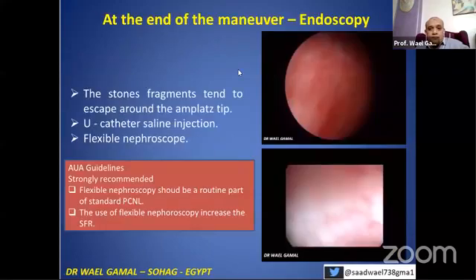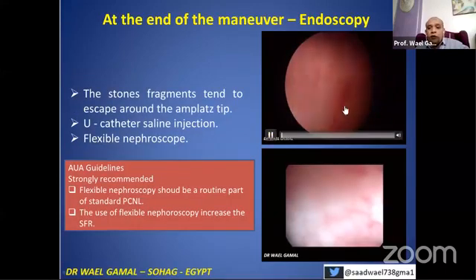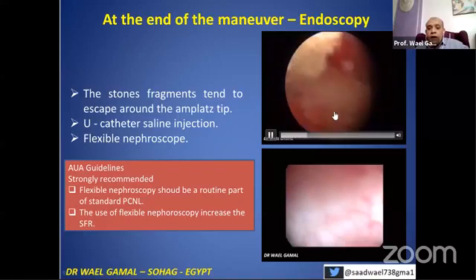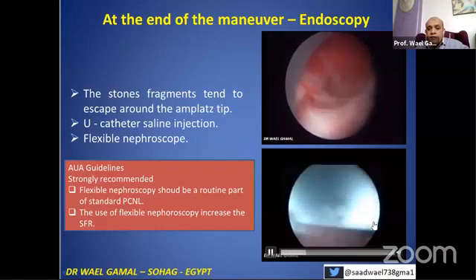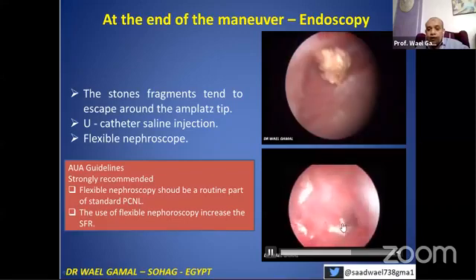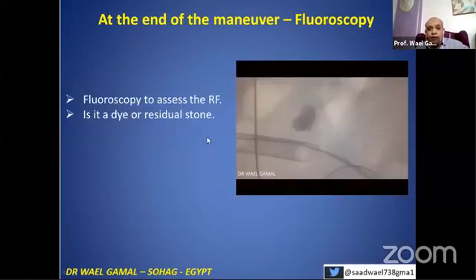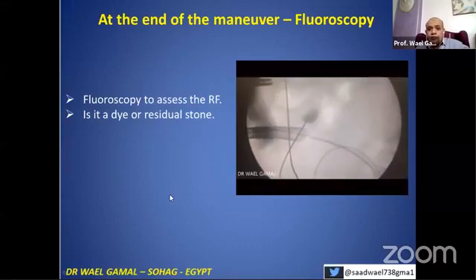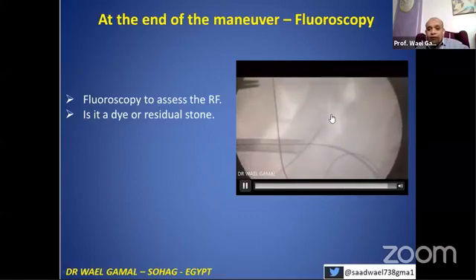At the end of the maneuver, we have to evaluate thoroughly. You have to evaluate the stone fragments — withdraw your sheath. Mostly there is a stone behind the tip of the sheath that has escaped, or gravel from disintegration. You need to evaluate this area very well. Sometimes massive disintegration produces gravel — withdraw the ureteral catheter and inject saline to clear any fragments. You should end your maneuver with the flexible nephroscope. According to American guidelines, this will increase the stone-free rate. Sometimes at the end there is a shadow — if I don't know if it is a stone or not, put your needle in this collection and inject saline so the dye disappears. It is not a stone; it is a calyx with retained dye.